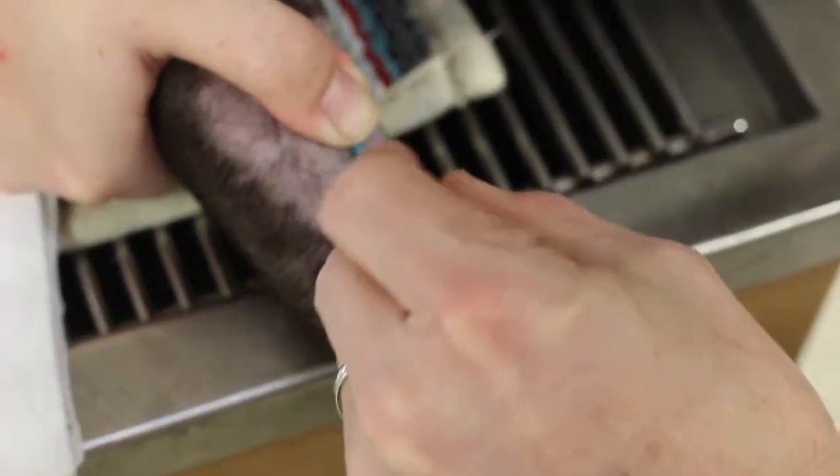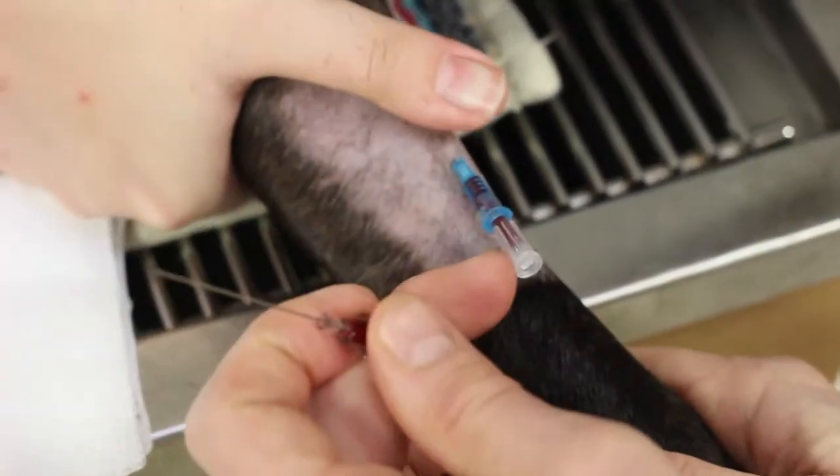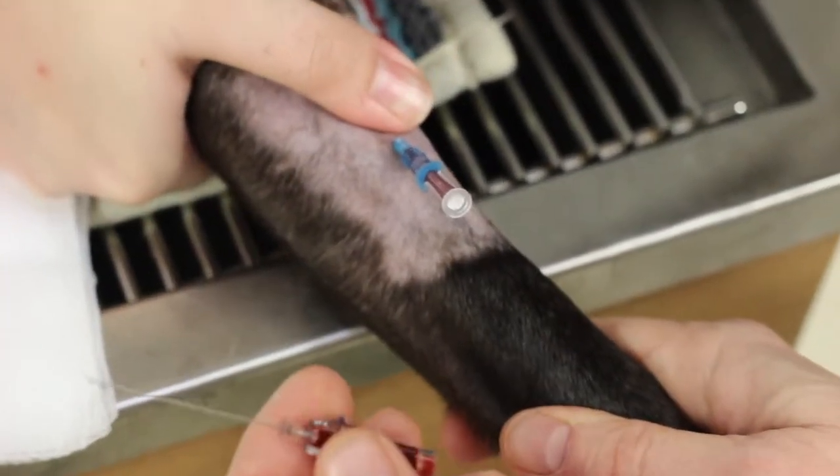She's holding that just so it won't bleed back. Then I put this cap on here, and if she lets her thumb up, it should fill up. It's in the vein, so we've got a nice flow. We know we're there. So that's great.